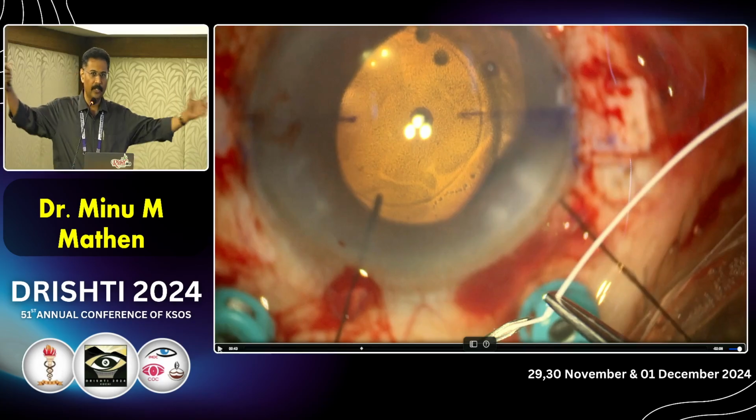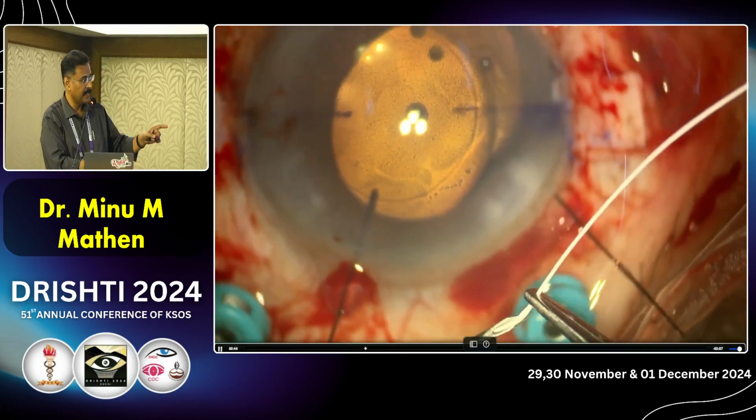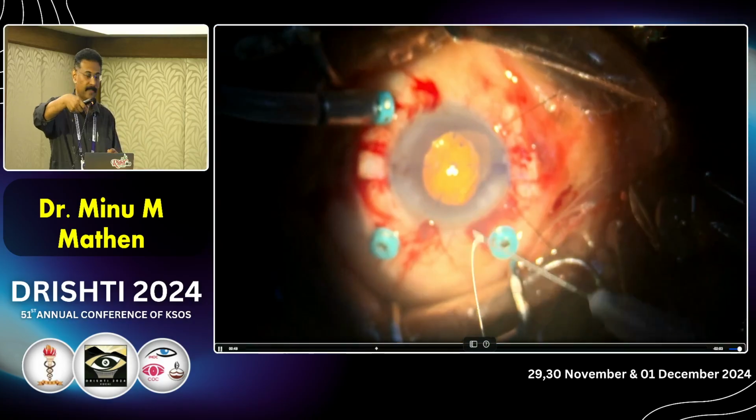Cut. This is a very long thread. You can make it into multiple things. Thread it inside, and while threading, it has to be dry. Be very, very careful. If it gets wet, it is very difficult. It won't go inside. Second thing is, using a forceps is very dangerous because it will flatten. If you press with this, it will flatten out this one. It will broaden. It won't go inside. So use your finger, dry finger, and a dry area, and thread it into this one. So thread it inside, and this will come out of the needle, and then put the syringe back on.